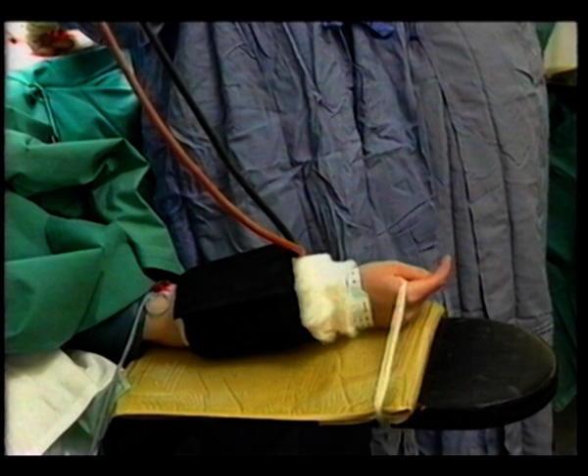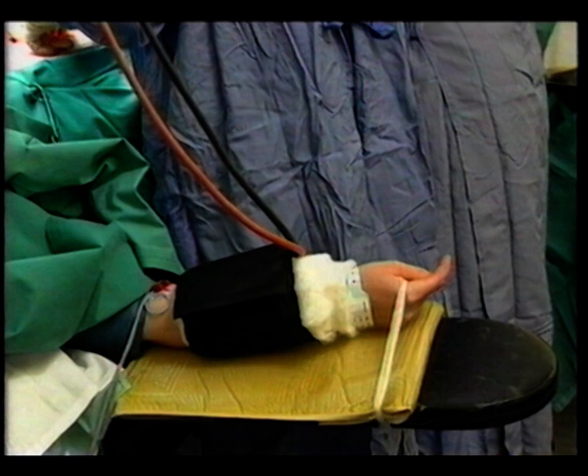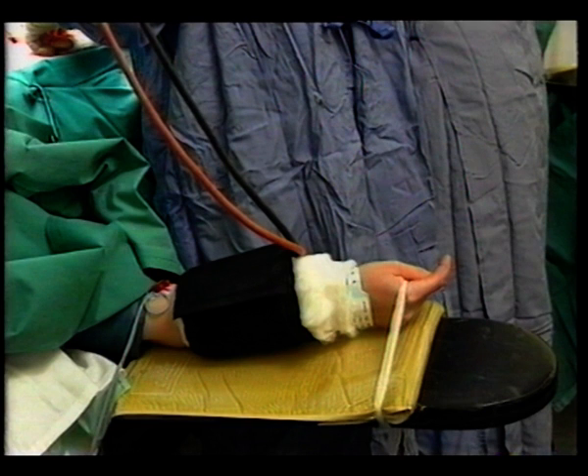What should you do if there is intraoperative movement of the hand? The simple answer is to increase the anaesthetic dose, but it is helpful to get some idea of the patient's condition, as is illustrated in the following example.